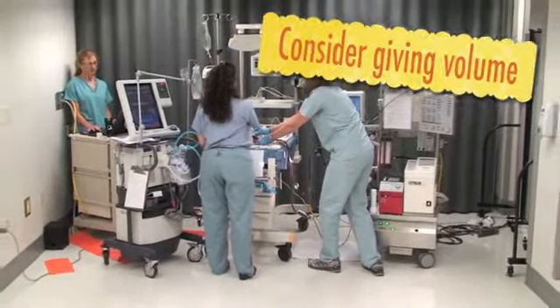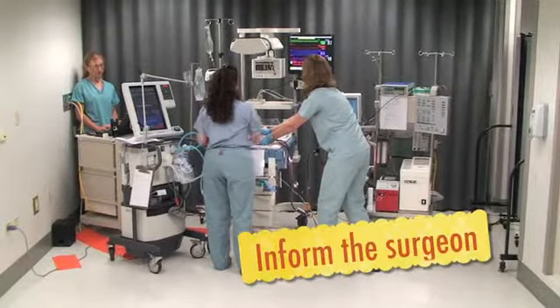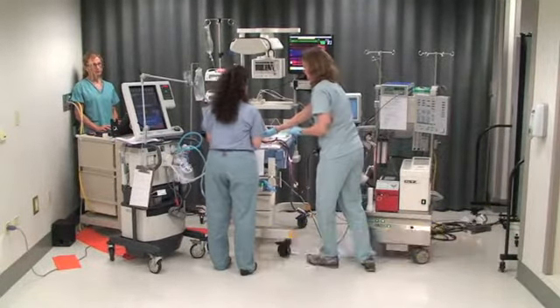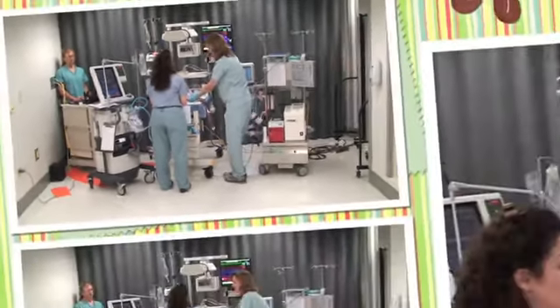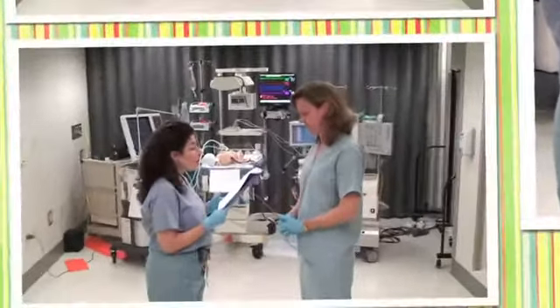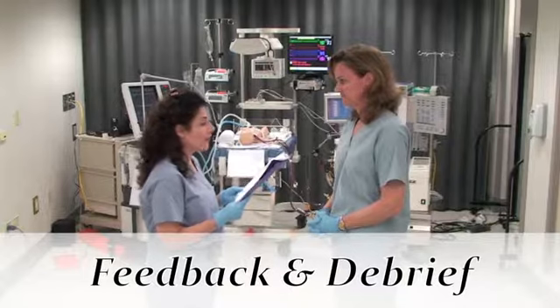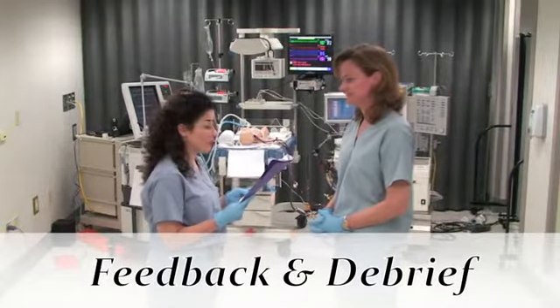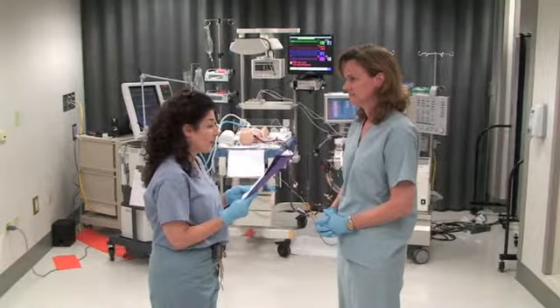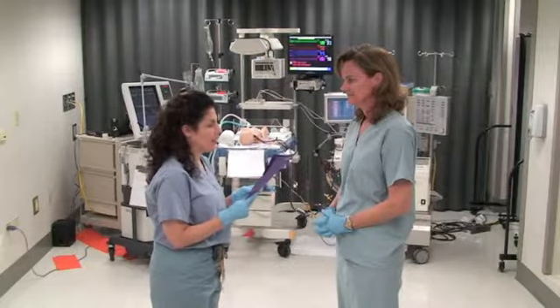Should I get volume? Coming back up? I think we're doing better. Good job. You hit all the key elements. You did a circuit check, you called for help, you checked the catheters, and you ultimately found the kink in the arterial cannula.